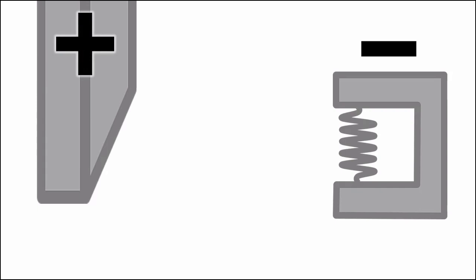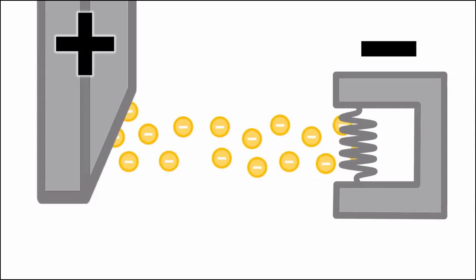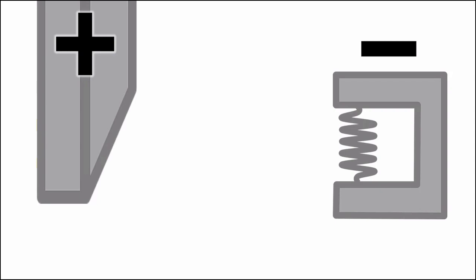During an X-ray exposure, the cathode is negatively charged and the anode is positively charged. This difference in charge is called the tube potential. We measure the tube potential in units of kilovolts. When we increase the kVp, this creates a larger voltage difference across the X-ray tube. This causes the electrons to move quickly, which then gives them more energy and produces a higher energy X-ray beam.